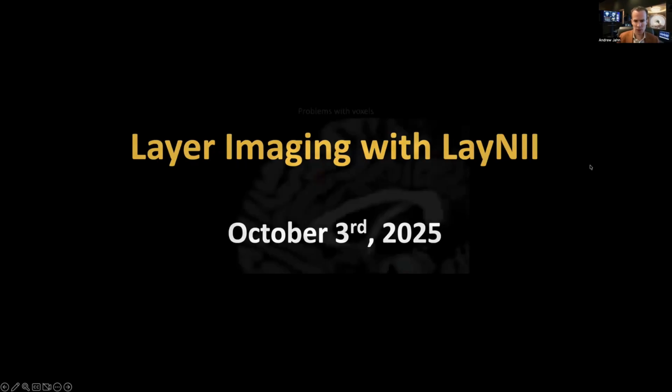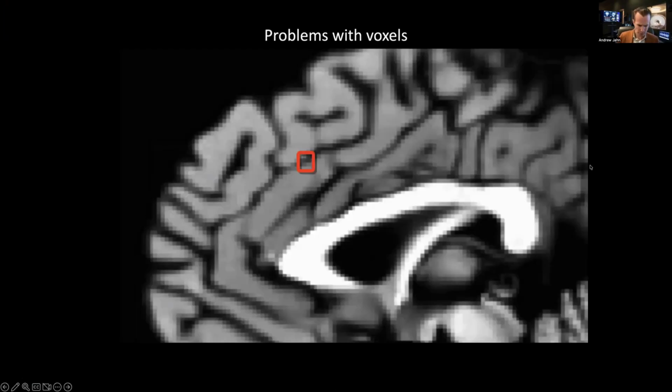If we take a look at something like FreeSurfer, just to motivate why looking at a finer resolution is such a good idea in general, when we have large voxels, let's say 3 by 3 by 3 roughly, this voxel here is especially large, but imagine that the underlying brain is the most faithful representation of the finer grained details, and my voxel here might be active, but it could be a smearing across different regions. Okay, so think of these different gyri as a placeholder for different layers, different columns, for example.